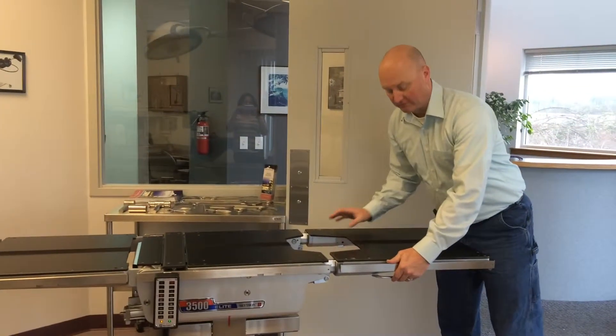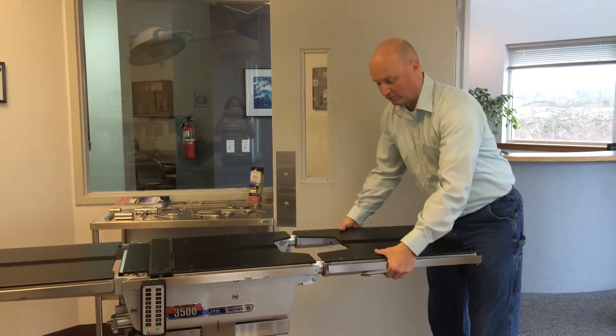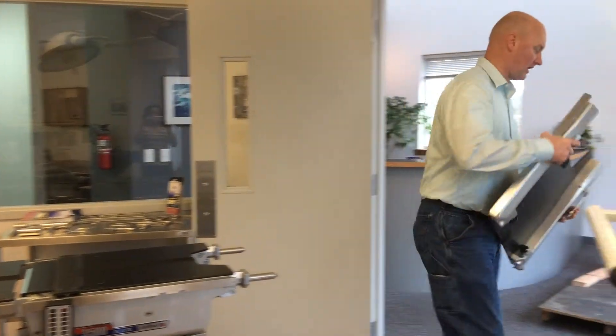Alright, so this is the 3500. The leg section here — there's two little levers on each side, you just pull those out, pull that off, and the leg section comes off.